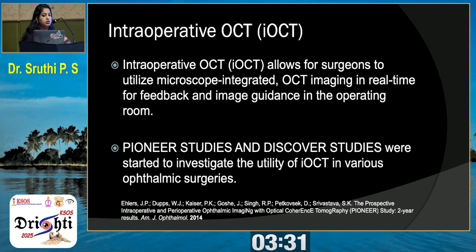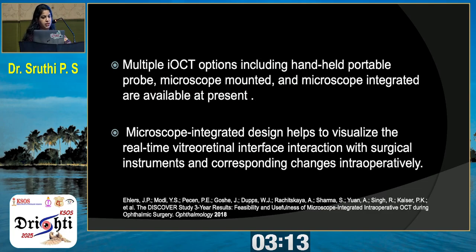Intraoperative OCT allows the surgeon to utilize a microscope-integrated OCT imaging system in real time for feedback and image guidance in the operating room. Two major studies are underway, the PIONEER study and the DISCOVER study, to investigate the utility of IOCT in various ophthalmic surgeries. Basically, handheld, microscope-mounted, and microscope-integrated types are available.